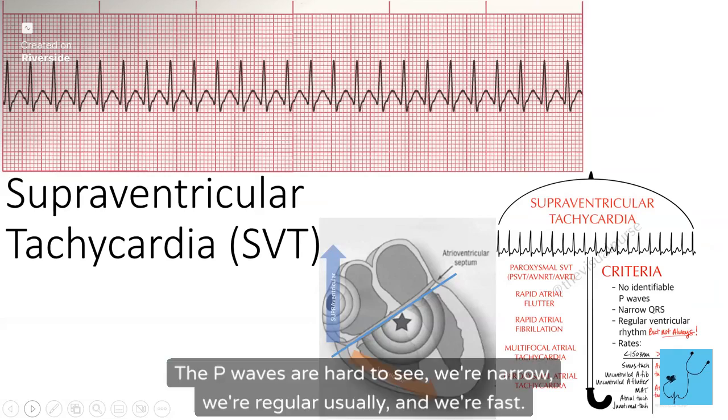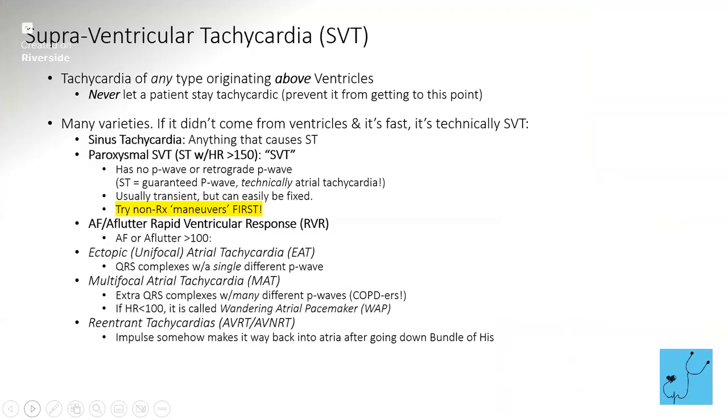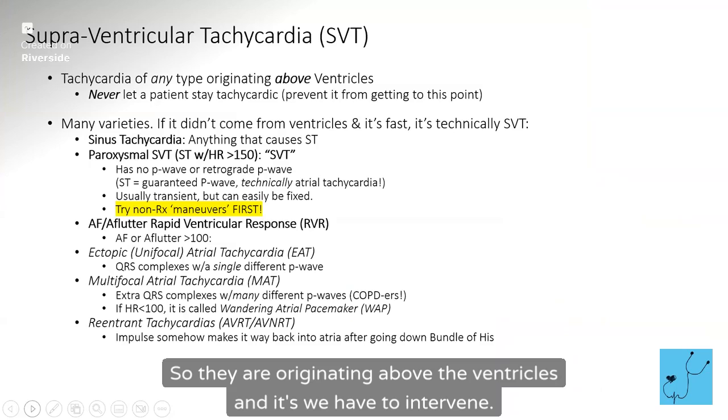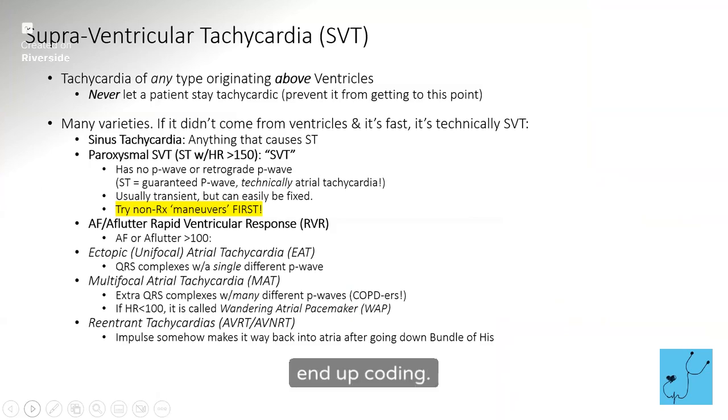Okay, so here's all of your criteria. The P waves are hard to see. We're narrow. We're regular usually. And we're fast, so we're like 150s, 160s. So they are originating above the ventricles, and we have to intervene. We can't let them stay tachycardic because their heart will get tired out and they could end up coding.